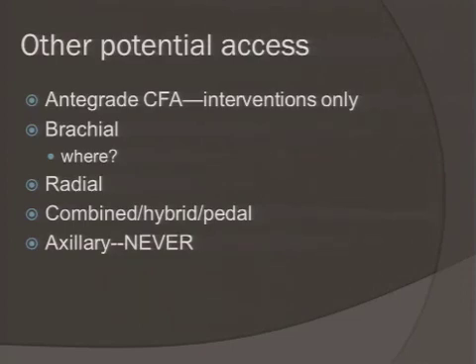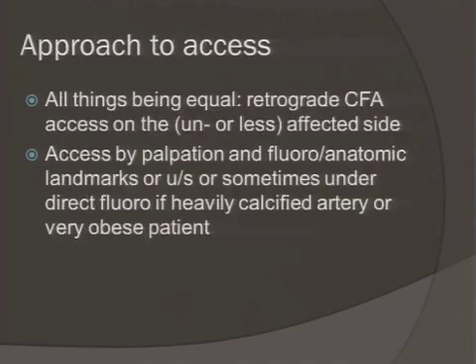Anybody done a true kind of old school axillary artery puncture, arm up like this and right over the humeral head? I think that's probably for historical purposes only. I don't think anybody does this anymore. No, we still do. You still do axillary artery punctures? It depends on the length that you have to travel.